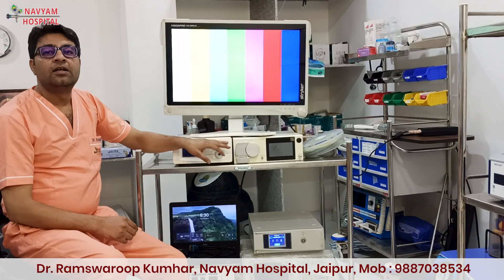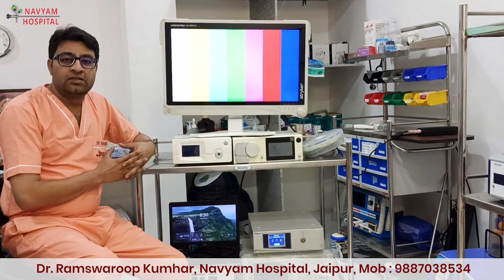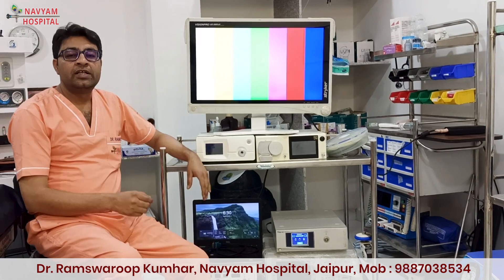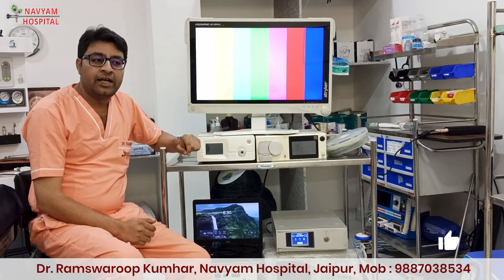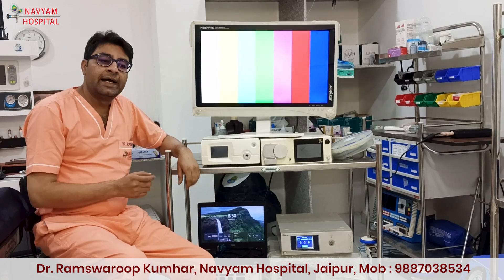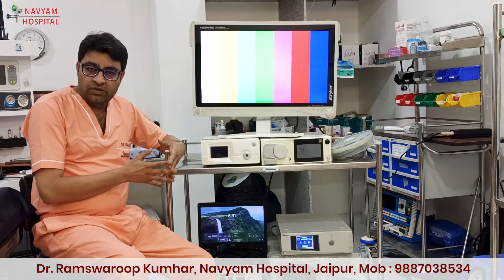And I purchased the morcellator 2 years back, because in the initial 2 years I was not doing myomectomy. When I got the expertise to do myomectomy, I needed the morcellator. So I purchased the morcellator for almost 1 lakh rupees only.